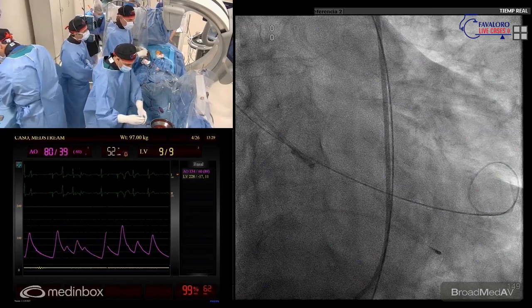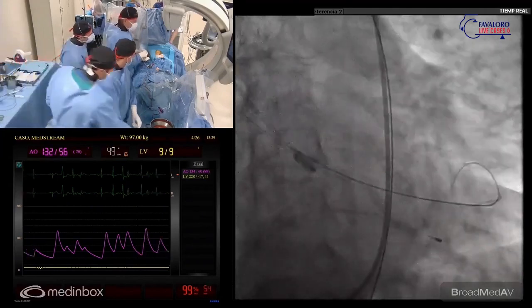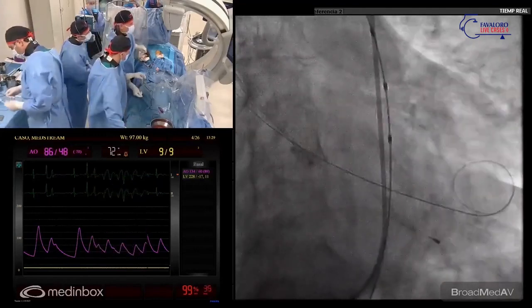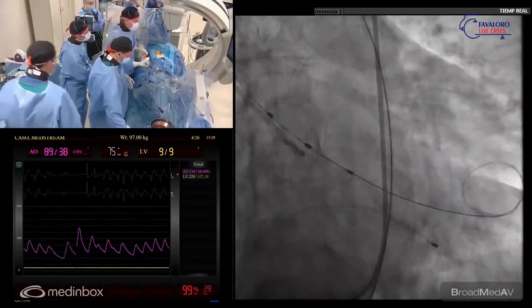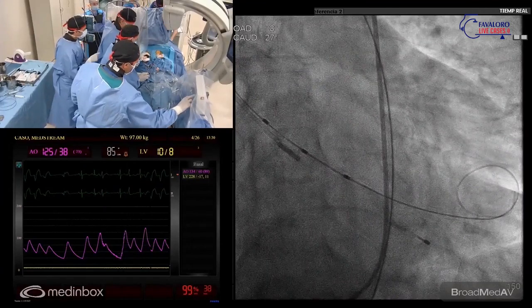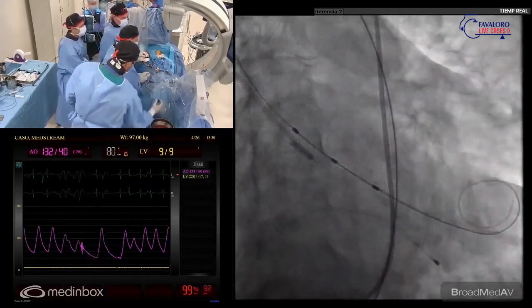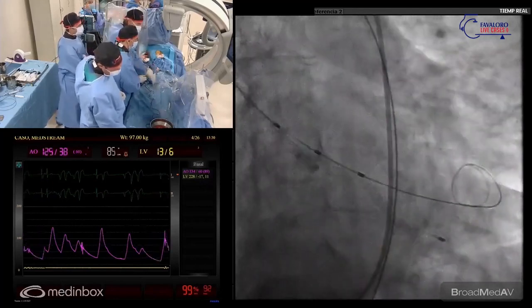We have explained that we usually reshape the Confida or the Safari for a smaller distal loop, and also a secondary bend, especially for self-expandable valves. It's much easier to retrieve the nose cone when you have this secondary bend. Yeah, I see how you put the second one. Also, you make it smaller. Yeah, so we try to make a very small distal loop. Okay. Here it was probably a little bit deformed, but let's go.